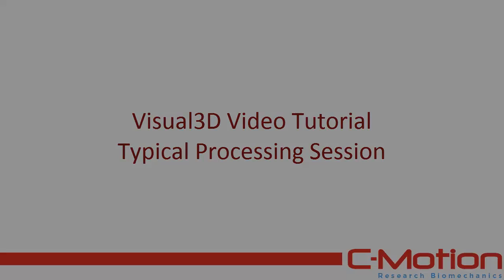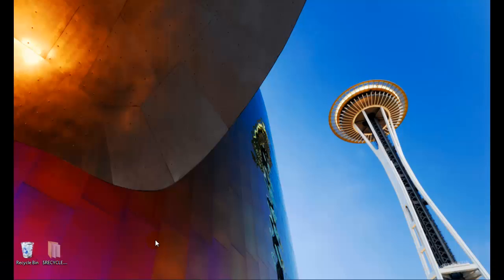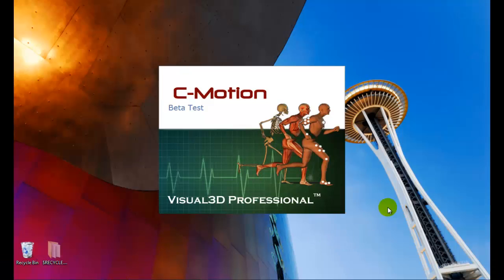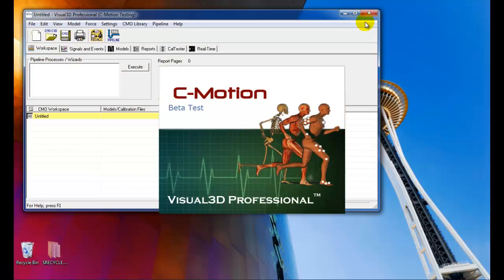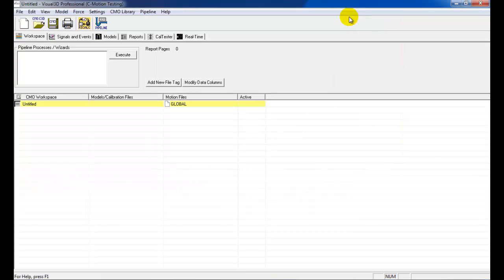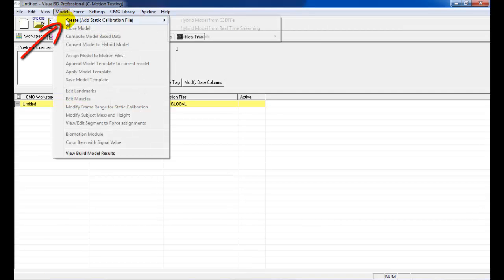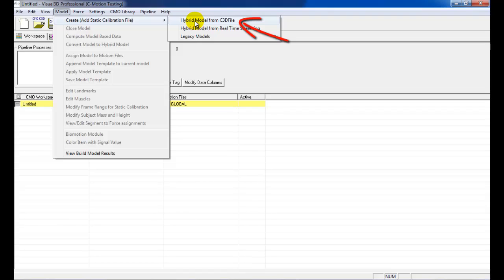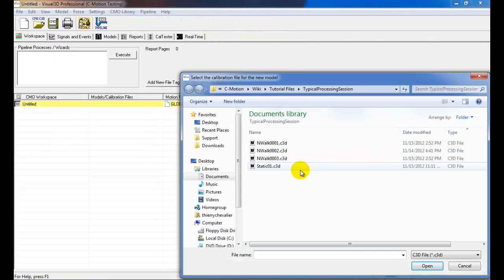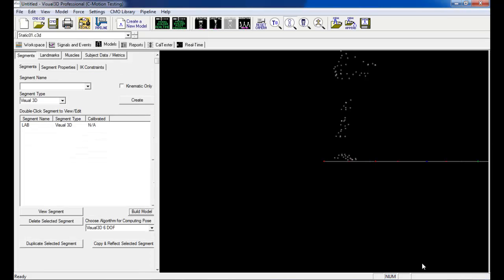In this case, the model template and report template have already been created and now only need to be loaded within the software. Once you've launched Visual 3D, you can load your model by selecting Hybrid Model from C3D File in the Create submenu found under the Model menu. Then simply select the Static Trials C3D File and click Open.